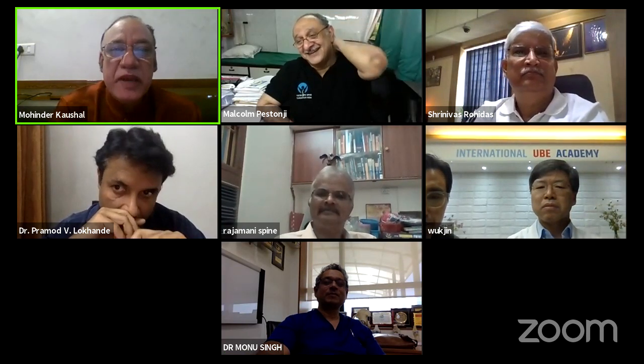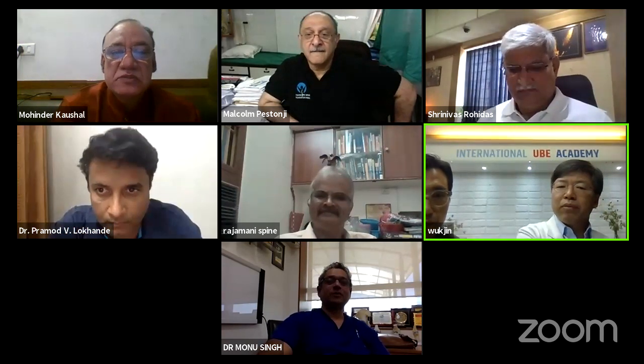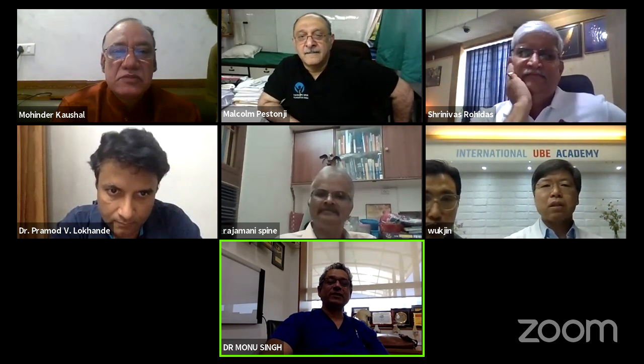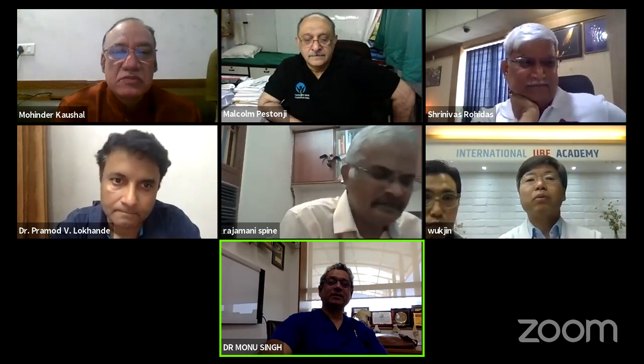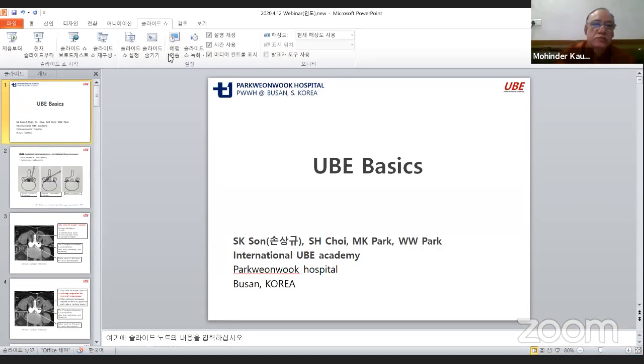Any questions from the expert panel to Dr. Rohidas while we wait for the presentation? Dr. Rohidas, I have one question. Where do you see the future of this technique, vis-a-vis interlaminar versus transforaminal techniques? Dr. Lokhande is a person who is well versed with both of them. The future is that these people have now changed to interlaminar. The interlaminar approach is really necessary if you want to tackle other pathologies. There is no doubt; they had to change to the interlaminar approach.